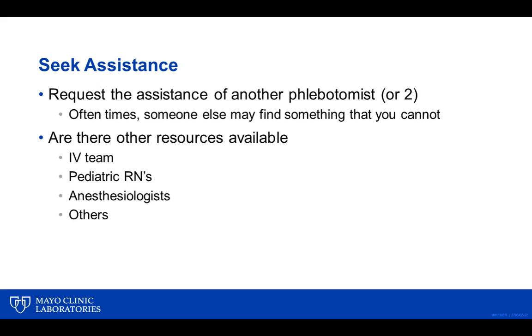The pumping of the fist, Tina asked that. Will that skyrocket the potassium? Yes, it will. It'll break down the cell walls. When you pump, after you get the tourniquet on, we have them just hold it tight. If you pump, the cells start banging off each other and the cell walls break down. And there goes your chemistries. It can alter your coags too, they tell us. So we don't want them to pump. We want them to hold a tight fist.